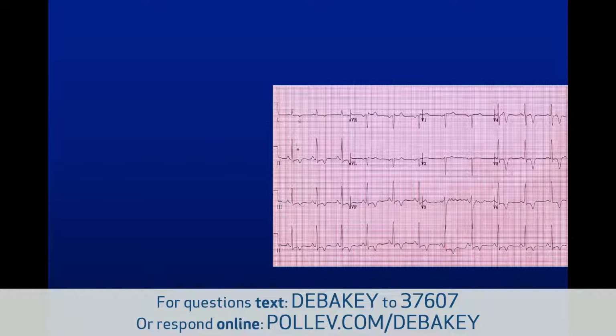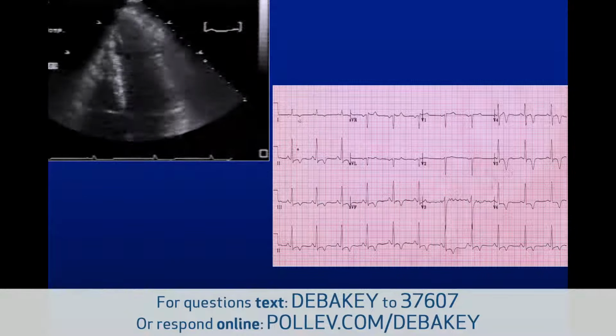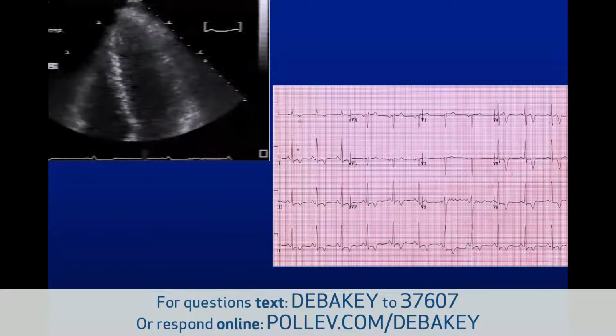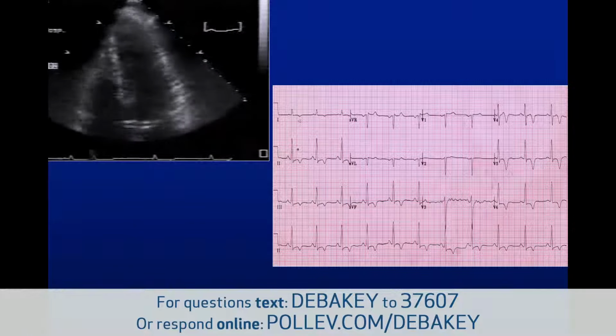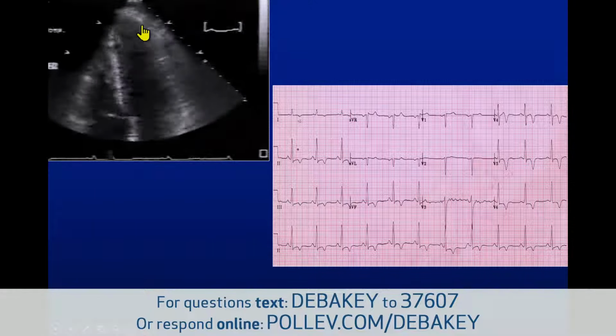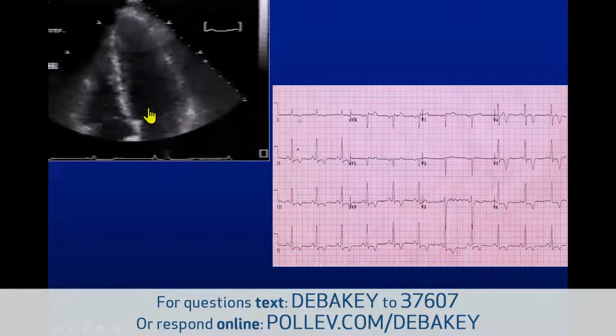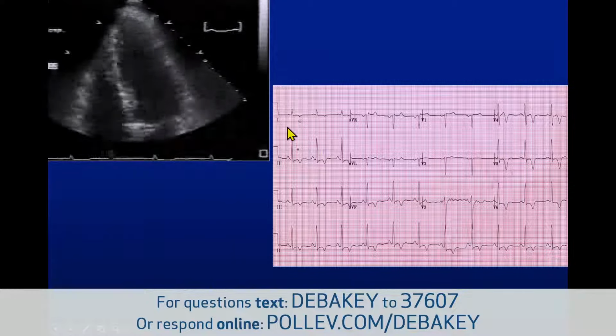A case here came in with chest pain overnight. You could see the electrocardiographic abnormalities, and you could see the deep T-wave inversions. Is this ischemic, yes or no, or is this a hypertrophic state? Don't know really. Is this LVH? It doesn't look typical for left ventricular hypertrophy per se, the garden variety, but this is your resting echocardiogram. Hard to tell regional function well. Maybe there's a problem in the apex, I'm really not sure, but it is suspicious and could conceivably evoke the abnormality, which are rather diffuse and maybe apical.